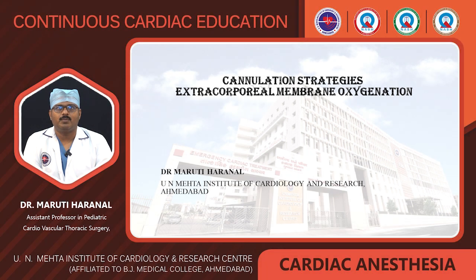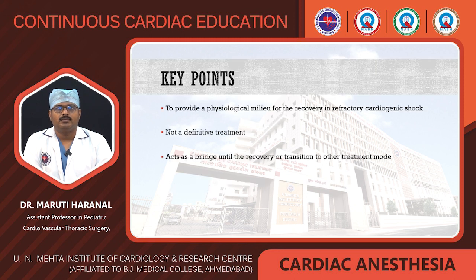In continuation with the ECMO series, I am going to give a brief overview on different cannulation strategies in extracorporeal membrane oxygenation. We should remember that ECMO provides a physiological milieu for the recovery of the heart in refractory cardiogenic shock. It is not a definitive treatment. It acts as a bridge until the recovery of the heart or transition to another mode of treatment.